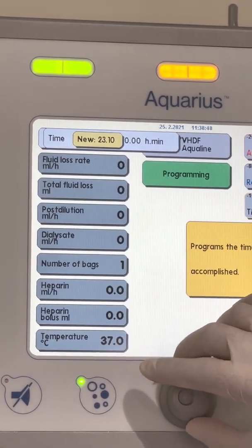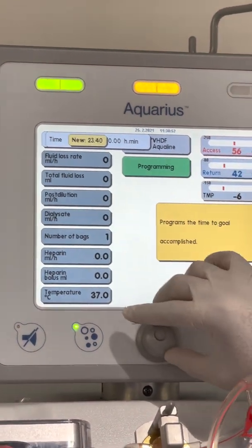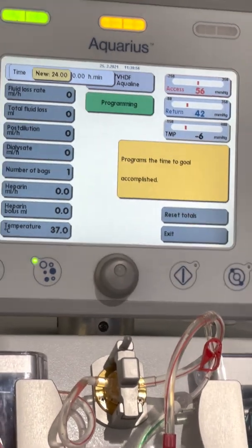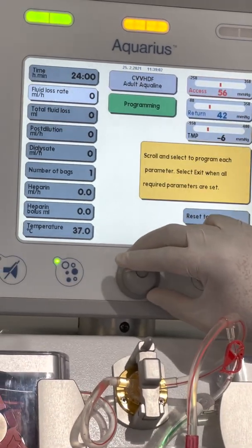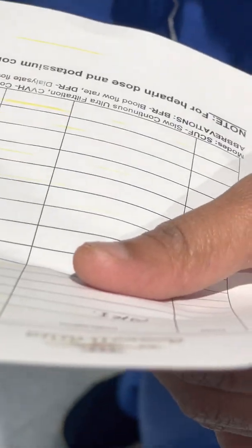But you can run it more than 24 hours if you want. Sometimes when it reaches 24 hours, it will show that you need to reprime again. So what you need to do is just increase the time. Make it 48 hours, then adjust also the parameters. So fluid rate, how many removal, as the order? 50 to 100. If the patient is vitally stable, start slow, start at 50.